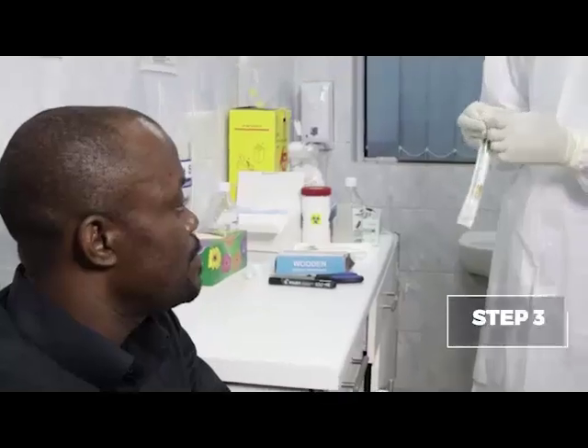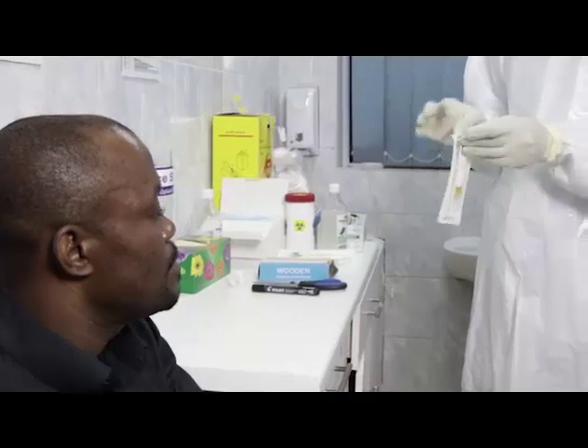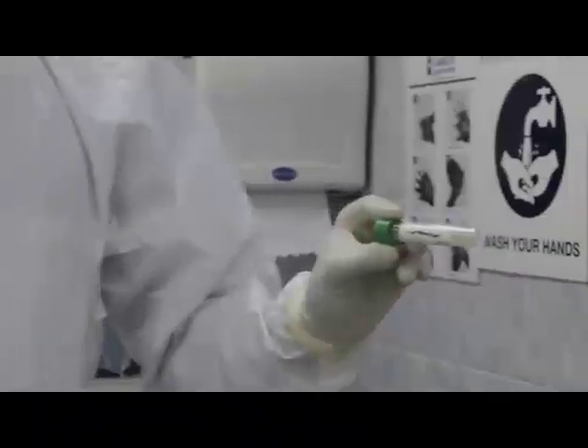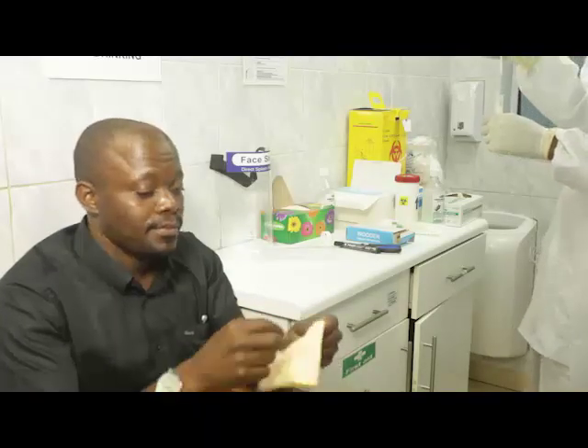Step three, remove the viral transport media vials from the packaging and label them with the date and patient identifier. Step four, ask the patient to blow their nose. Step five, position the patient in a comfortable position with their head against the wall.